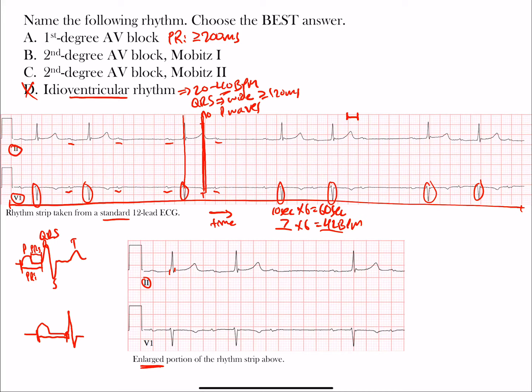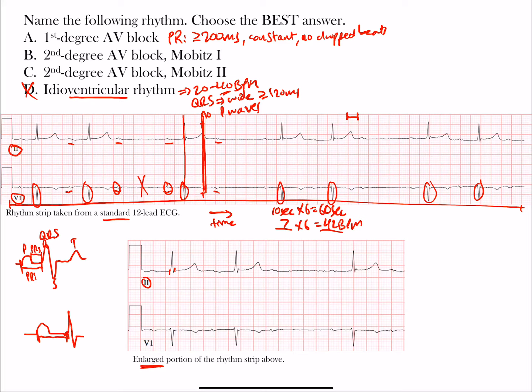The PR interval — or PQ interval if a Q wave starts the complex — is generally what we use. If that interval is more than 200 milliseconds and constantly prolonged with no dropped beats, that is a first degree AV block. However, we can see P waves with no QRS following between them, meaning there are dropped beats. First degree AV block has no dropped beats, so it is not correct. It must be one of the two second degree AV blocks — Mobitz Type 1 or Type 2.